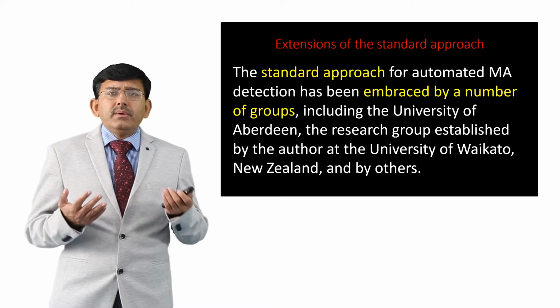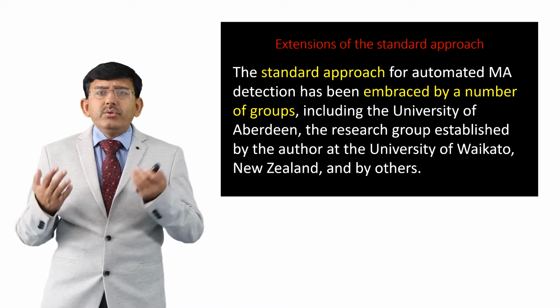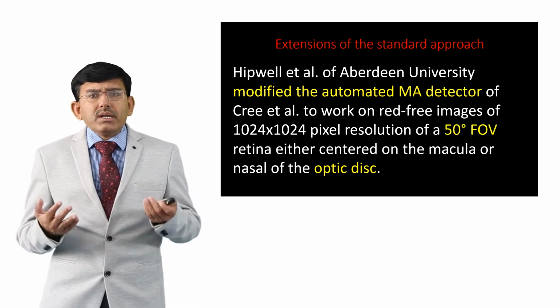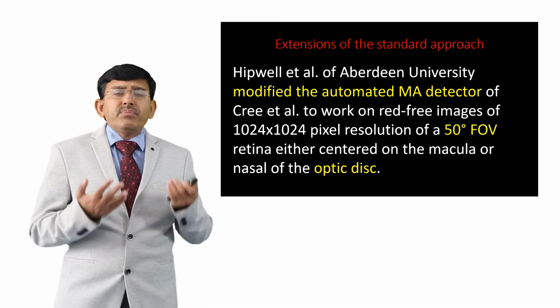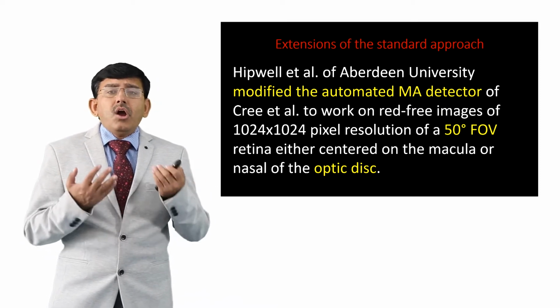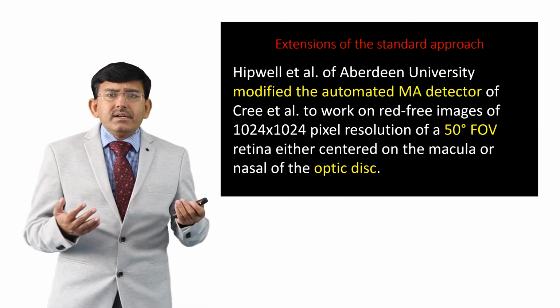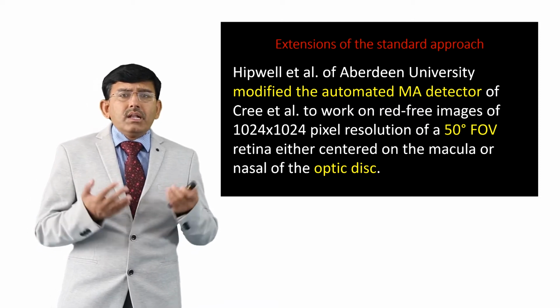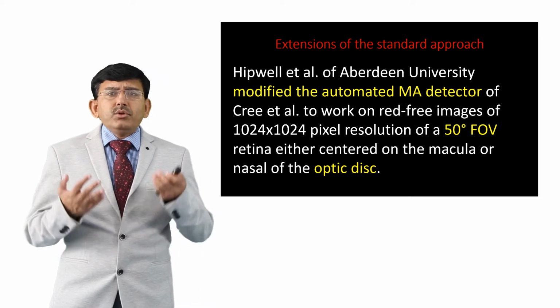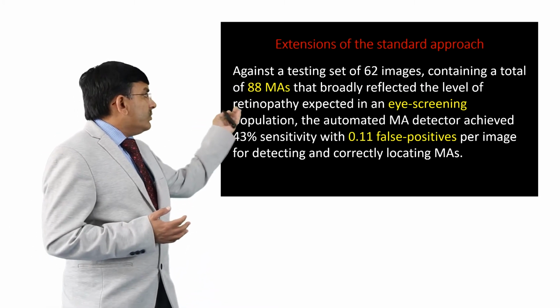Hepwell and his group of Aberdeen University modified the automated microaneurysm detector of Cree and his group to work on red-free images of 1024 by 1024 pixel resolution of a 50-degree field of view retina, either centered on the macula or nasal of the optic disc, against a testing set of 62 images containing a total of 88 microaneurysms.